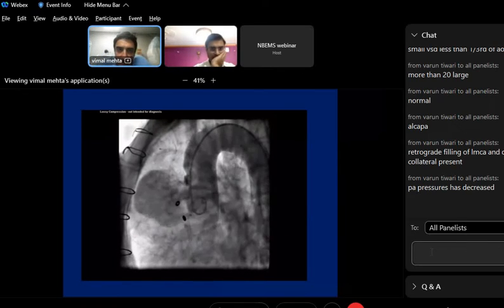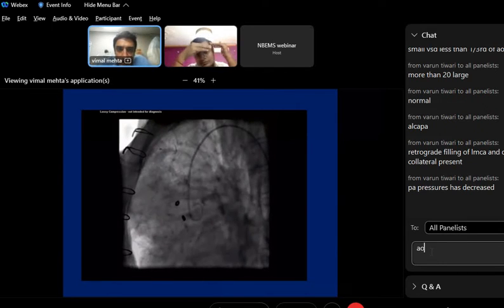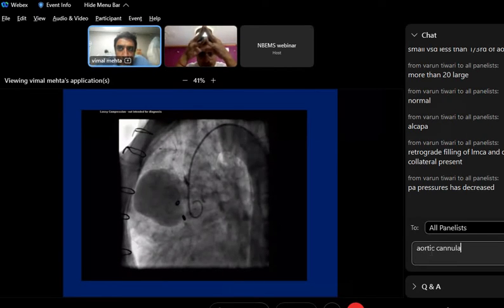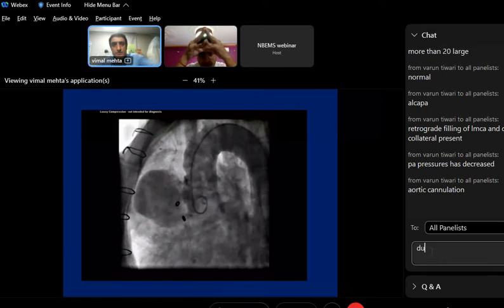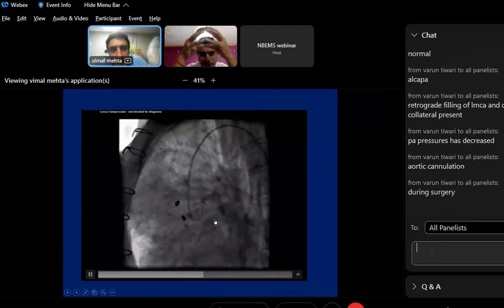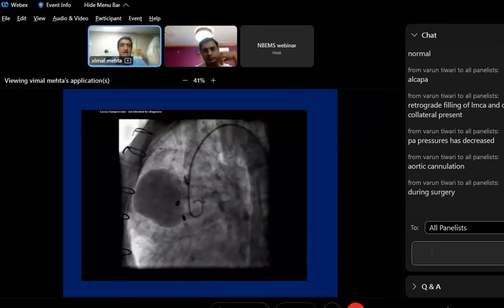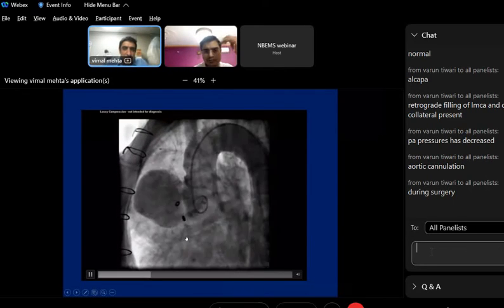Obviously, people will be interested in knowing if somebody has a huge aneurysm, obviously. And pseudoaneurysms have a tendency to rupture. So this is a big issue, big problem. Aortoarteritis? Why aortoarteritis? It can result in aneurysms, but typically they are generally saccular dilatations. Not this, this has a very narrow neck actually.